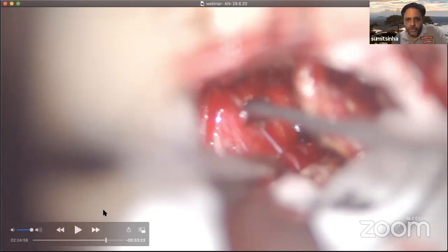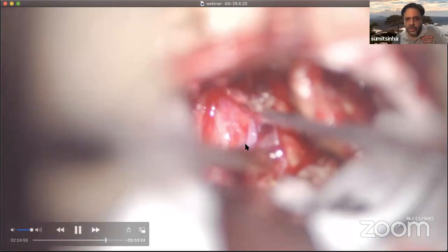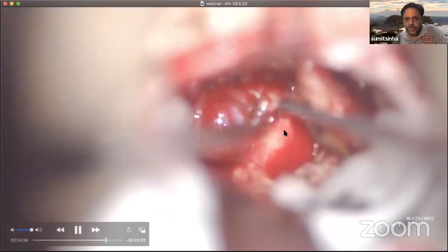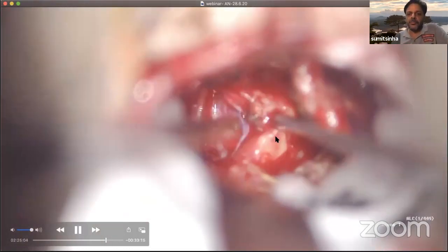Before I answer your question, I want to show the delegates something. This is the sixth nerve, which is on the superior pole that you are seeing here. And you see the arachnoid membranes over here separated from the superior pole of the tumor. Now, to answer your question, this is exactly what I'm doing here.